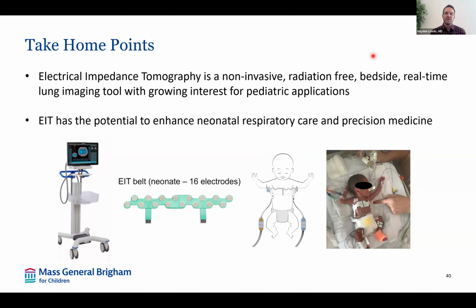And I think that's an area of active research for us here in the pediatric ICU: finding who has recruitable lung disease and who doesn't, who may benefit from higher PEEP strategies and who may not necessarily be harmed, but may not benefit from those higher PEEP strategies, in which case maybe the perfusion and ventilation is improved when we go down on PEEP.